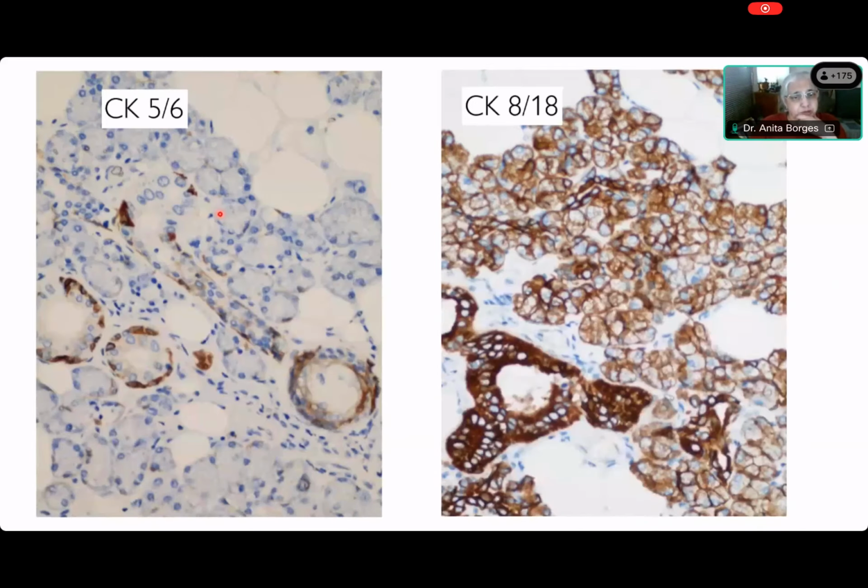Similarly about CK5/6. CK5/6 is expressed essentially in basal cells. You don't really see it too much in myoepithelial cells. You do occasionally, but in the salivary gland, see how it is marked in the basal cells of the striated duct. CK8/18. What is CK8/18? It's a very low molecular weight cytokeratin, and anything that is epithelium will mark with CK8/18. And if you remember how very poorly the acini were being marked by AE1/AE3, because AE1/AE3 is a combination of high and low molecular weight keratins of different sorts, you'll find that in very low molecular weight keratin, see how the big ducts of course will mark, but all the acini will also mark with this.